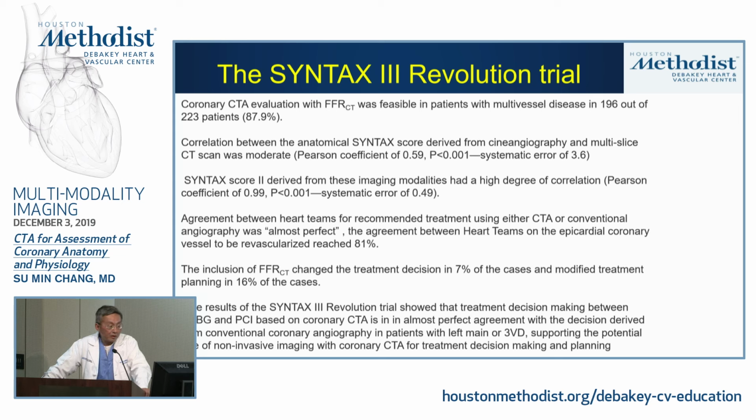And I think they're doing a clinical study in Europe based on exclusively, basically they're getting rid of invasive angiogram. Okay, so there's going to be a clinical study just using patient with severe disease needing revascularization, decision made based on CT plus CT-FFR versus invasive angiogram only.